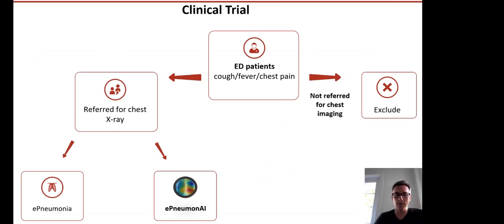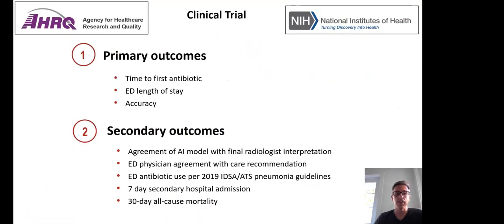And so our clinical trial, which is now ongoing in 55 clinics, is looking at the difference in outcomes at the point of care with the use of this tool in the workflow. So a multimodal data fusion model that is taking in clinical context and the pixel data to help make a clinical decision. And this is currently funded by the AHRQ.